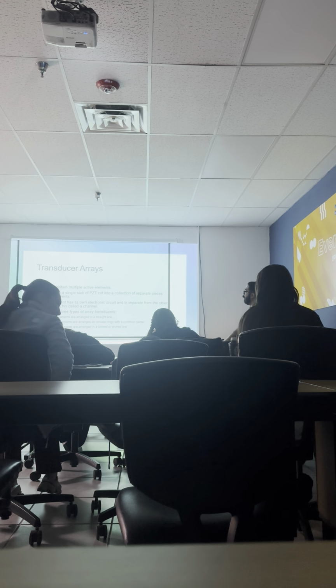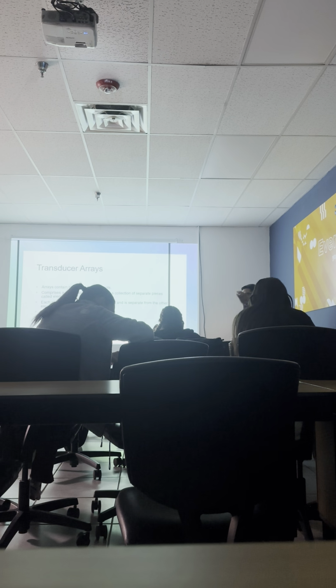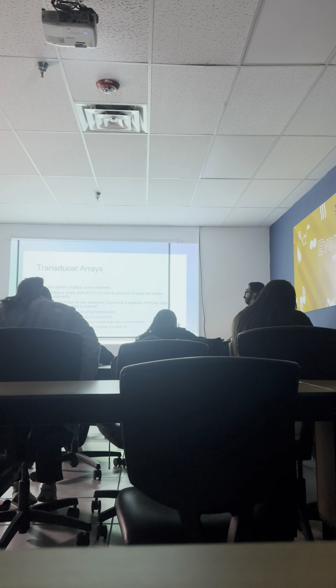Okay, there are three types of array transducer. We have the linear array, which is that flat one that's used for small parts, or for superficial imaging. We have annular.